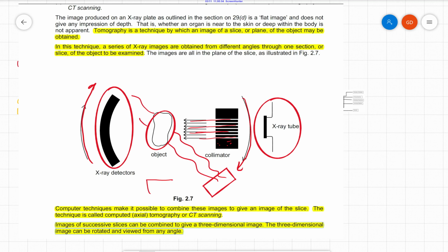Penetrating at different angles, as we said, provides us with the two-dimensional slice or a pixel. Sliding the patient along the Z-axis, getting the slices again, building up the slices together, you get the voxel or the three-dimensional unit. When these units are built all together, we get the three-dimensional image of the organ. Okay? Now this is the end of the first part.